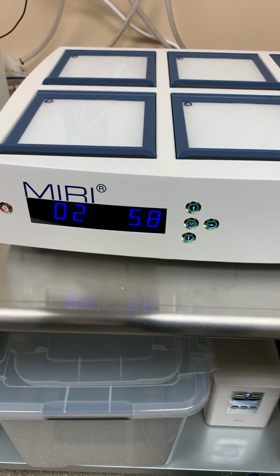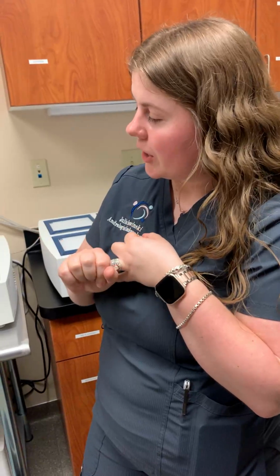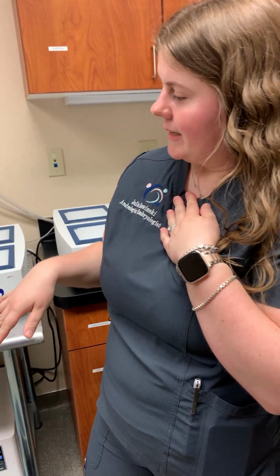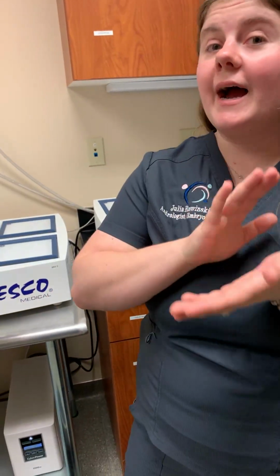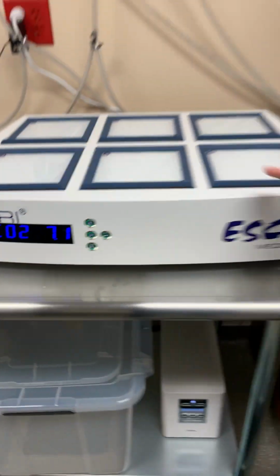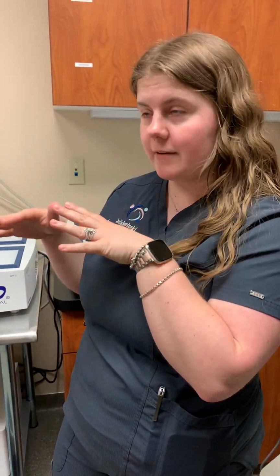And the point of the gases is to keep the embryos in a pressurized, not necessarily pressurized state. So you're keeping them in a gaseous state that's a good bit closer to the female body. Okay. So that's what we're going for. As time's gone on, they've tried to figure out what the difference is in oxygen, and we operate in a low oxygen. We're at 5.8 for our oxygen, and then we're using nitrogen to balance that, to get our oxygen levels lower, and our carbon dioxide is kept at 7, hold on, I'll come through here. I optimized it recently, so 7.1.